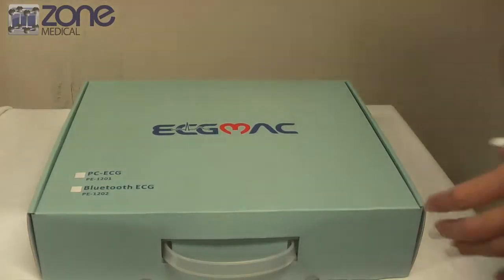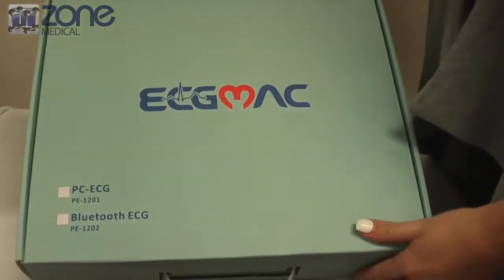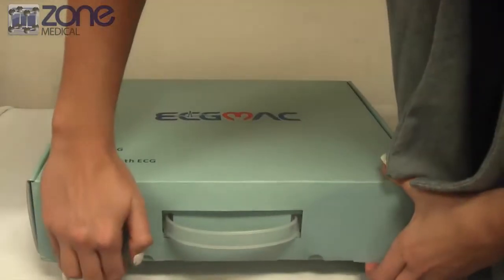Today I'm going to be giving you a quick startup guide to your new ECG Mac. This includes the unboxing of the new ECG Mac and also the installation process.